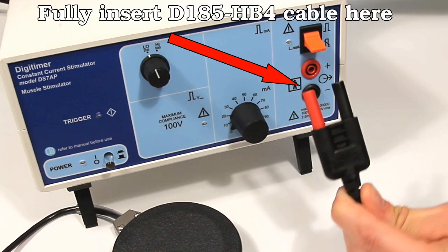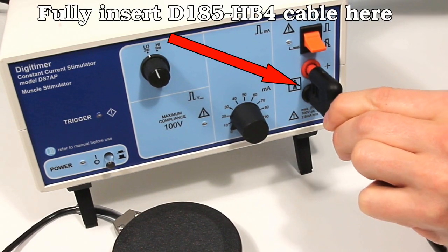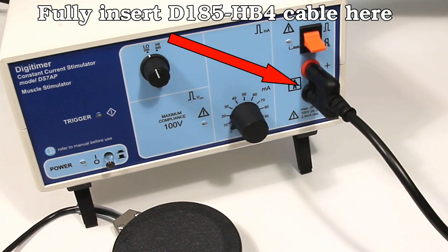Turn the stimulator around and connect the D185HB4 electrode connection cable to the stimulator output sockets, ensuring that the plug is firmly pushed in.